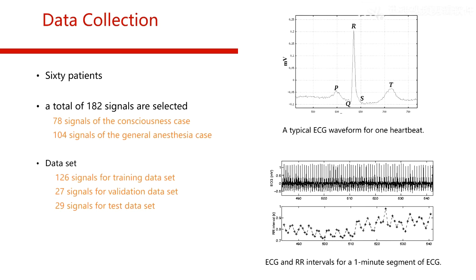The RR interval means the time between the R waves in two QRS. The picture below illustrates how ECG and RR intervals typically change for a normal subject at rest over about 60 seconds. So you see, this is called an HRV signal.